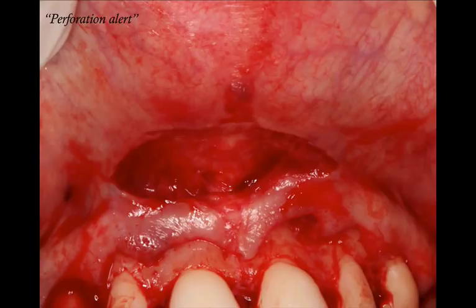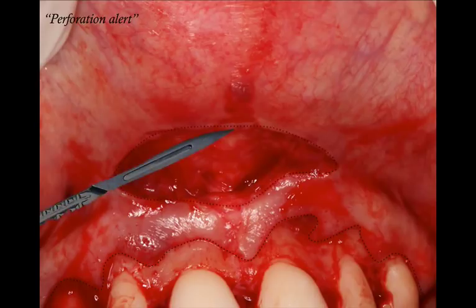Be on your toes. So the way we handle that, we will create an incision that is, again, very parallel to the flap. You're basically dealing with pure periosteum right in here. And you can use the number 15 blade to create some scoring right here. You'll scar the periosteum, but the flap will still be intact. So you'll use this blade only in the part that is non-attached, that you didn't reflect yet. And this way you'll avoid a perforation. But the perforation risk is always there. You got to be very, very careful. Once you're done with this process, the next part is to suture the flap.